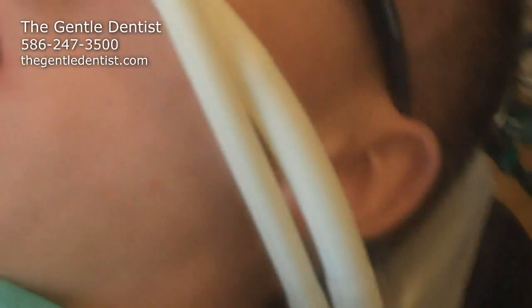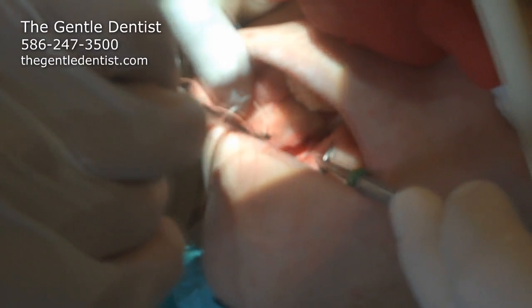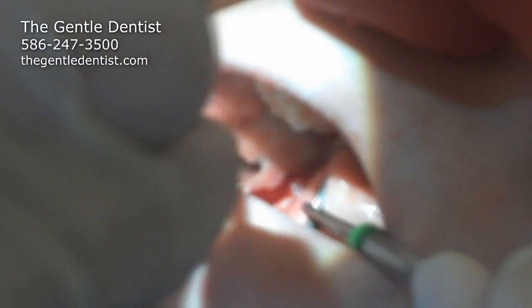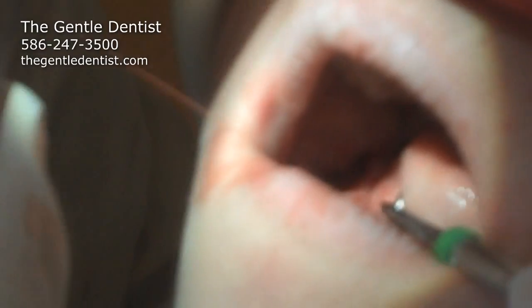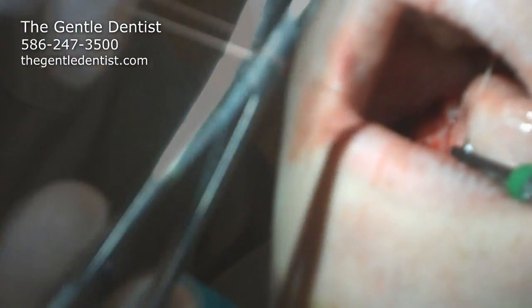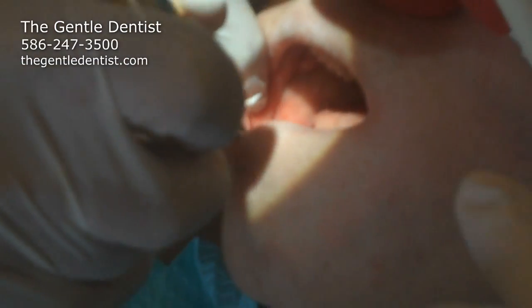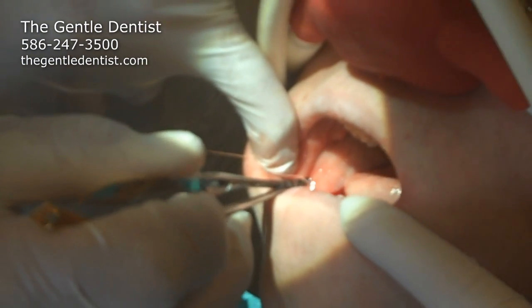There it is. So I'm just putting a stitch in here. It's just like basically doing some sewing here. So of course Marshall's nice and numb, so he's good. So the idea when we put a stitch in like this is if we can approximate that soft tissue that was together there, then, okay, go and cut that. If we can approximate the tissues, they'll go ahead and heal nicely together. That's good. One more.